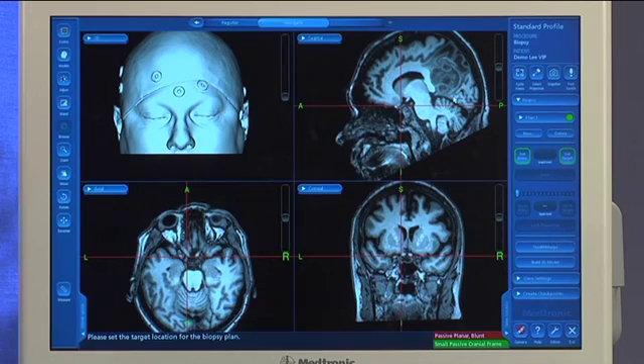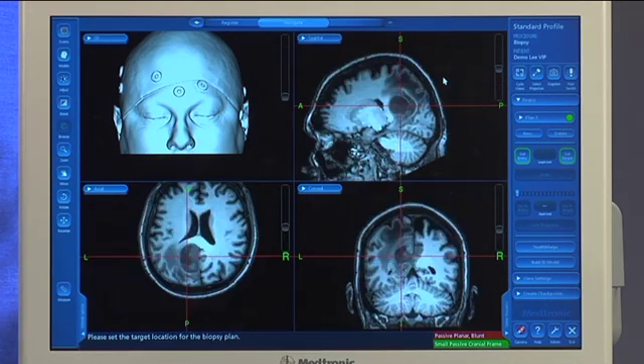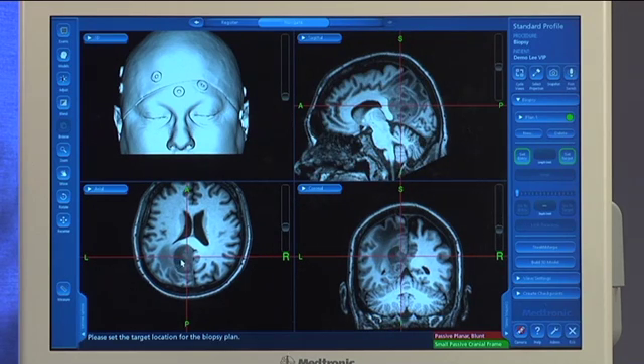To do so, we'll come in to our images here, we're going to scroll through, and here we want to click inside the tumor in your target area. Once you have your target defined, you simply come in and select set target.